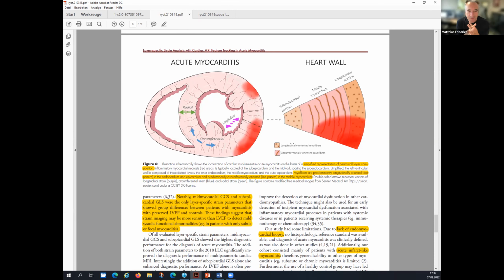Okay, thank you. In the interest of time, just allow me one more quick question before we have to call it a day. What do you think is the actual spatial resolution? If you have a wall that's just, let's say, 6, 7, 8 millimeters, and then the images themselves, we know each pixel kind of bleeds with its information to the neighboring pixel. So what do you think is the actual spatial resolution? It apparently was good enough to discriminate the different layers, but is there a limitation, or do you think we're in a comfortable space there?